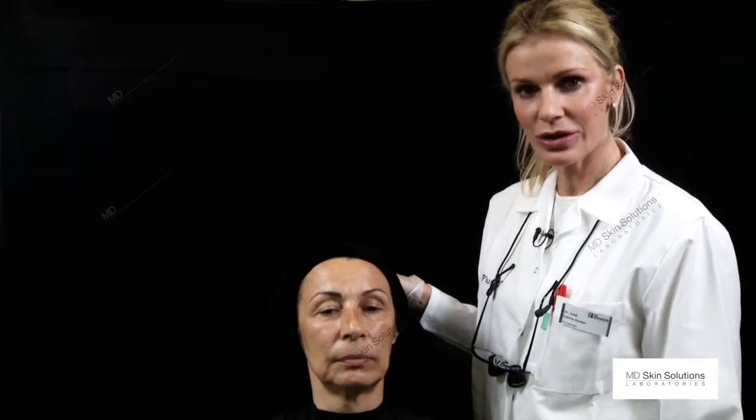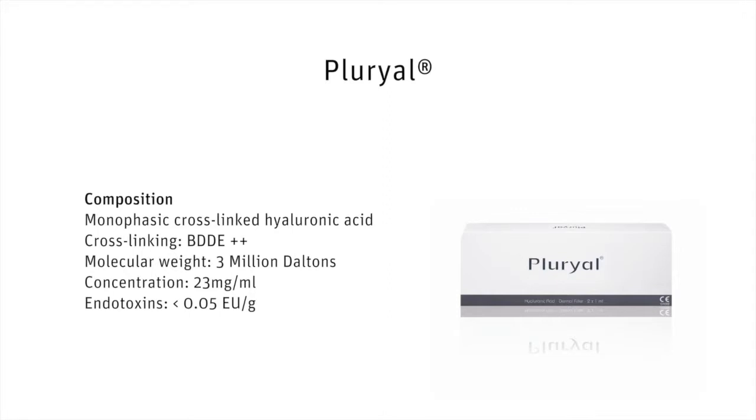This section will show the use of the Pluryal filler line. Pluryal fillers are hyaluronic acid fillers, monophasic, cross-linked with BDDE, with a very low endotoxin level. So we will show a case of Pluryal and Pluryal volume.